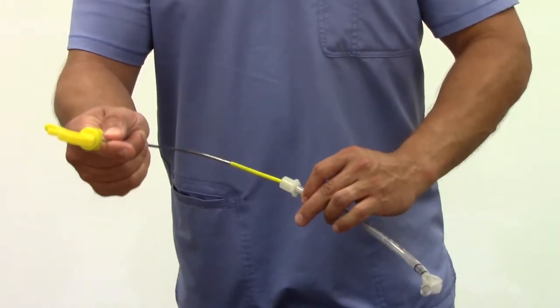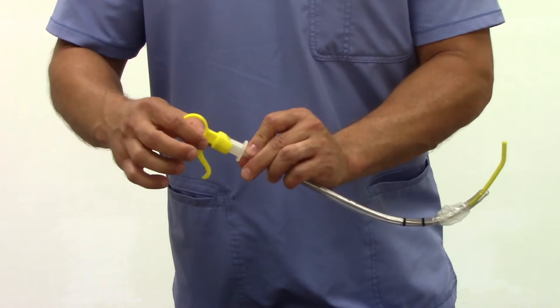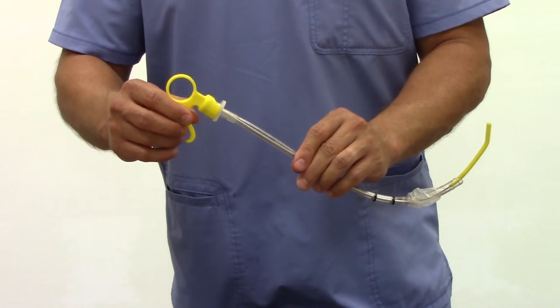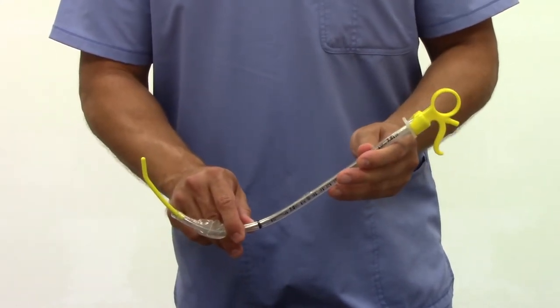At this point, after lubrication, the J-WAND is inserted into the endotracheal tube with care to seal the handle over the distal connector of the endotracheal tube. At this point, the stylet is in place and ready for intubation.